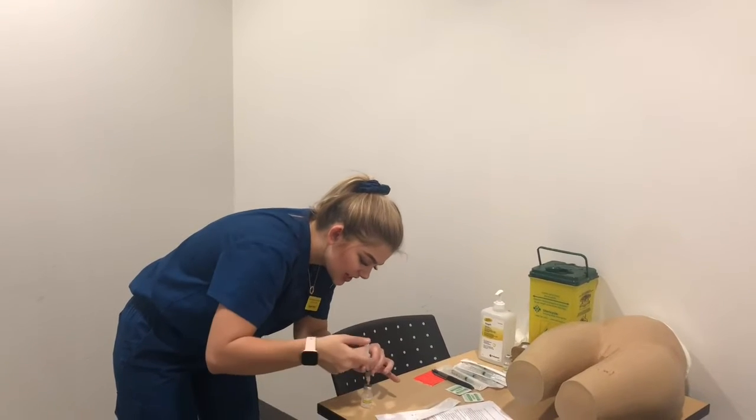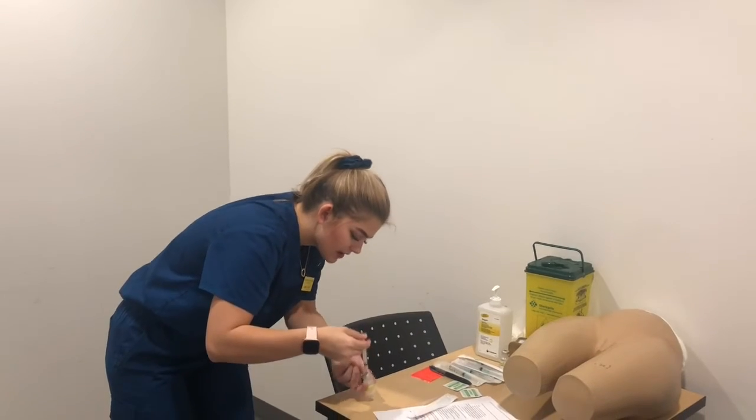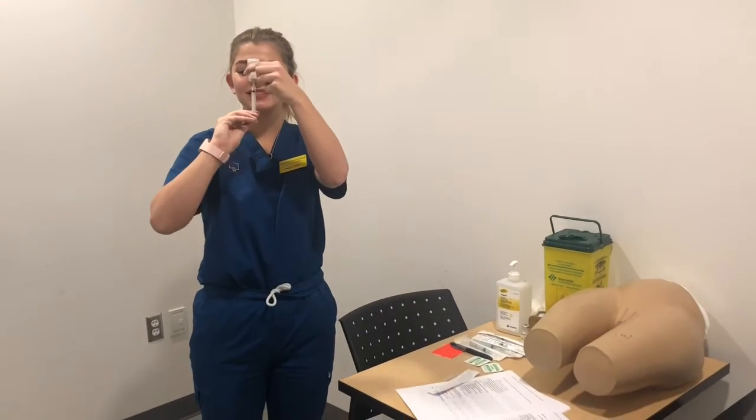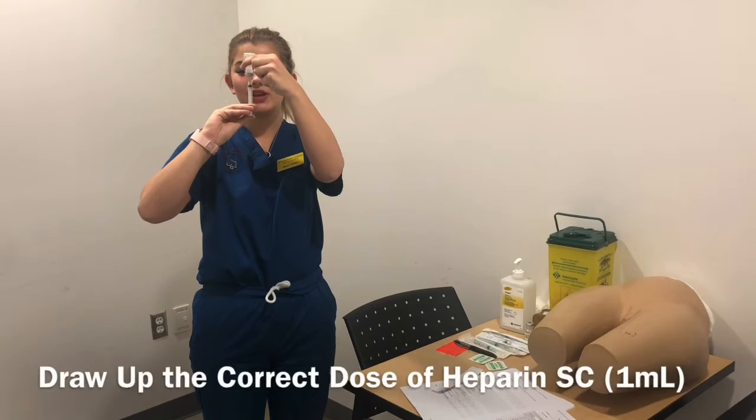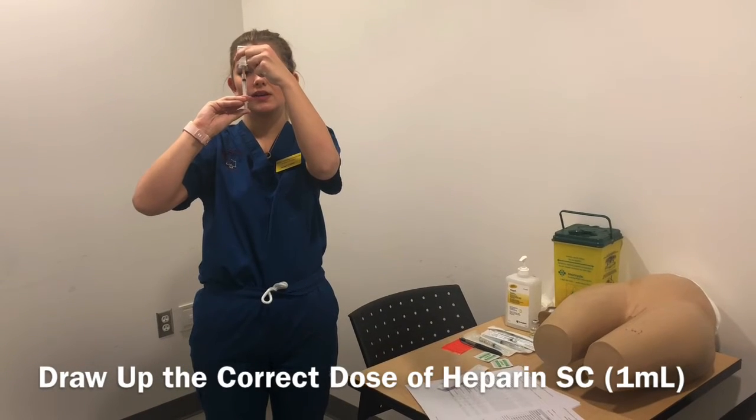Okay, you're going to want to inject the air into the vial for the pressure. Flip the vial upside down, and then you're going to draw back until you get the desired dose.